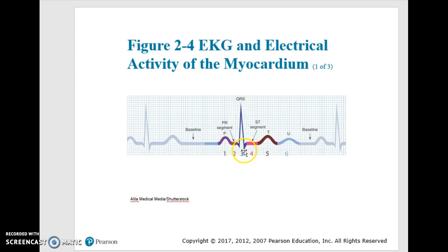And the reason you will always have a QRS that follows the P wave is because in a first degree block, there's only a delay. All impulses get through, and because all impulses are able to get through, a QRS is written because the ventricles will contract.